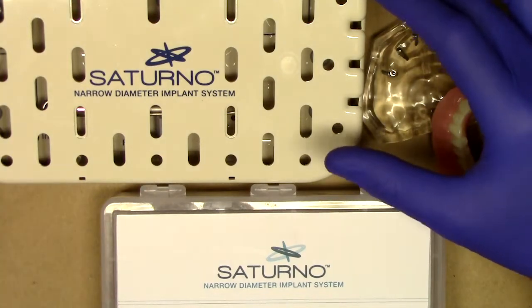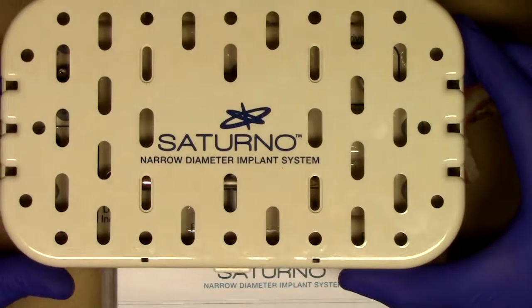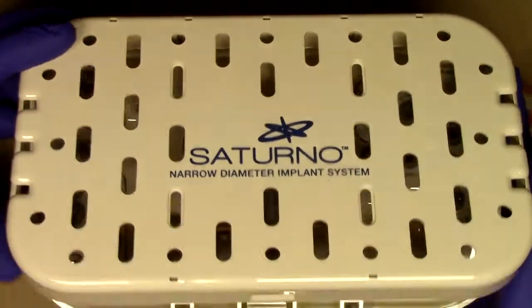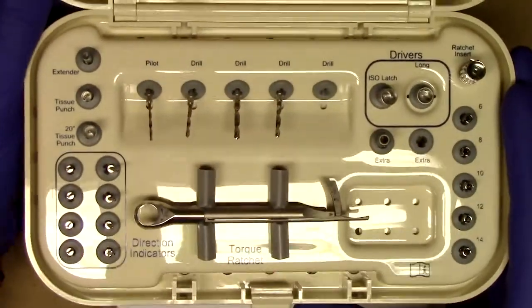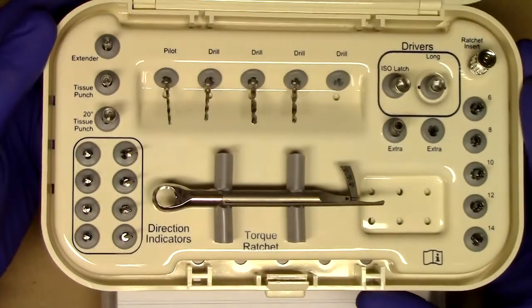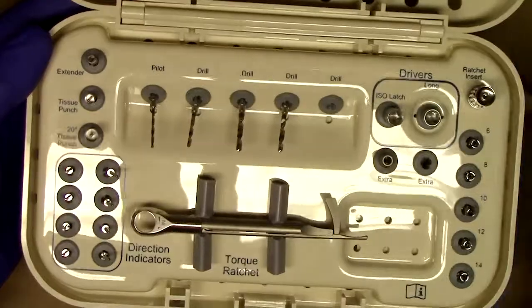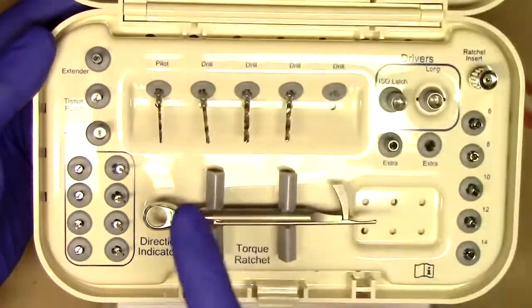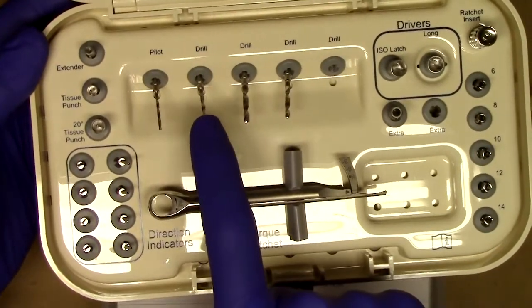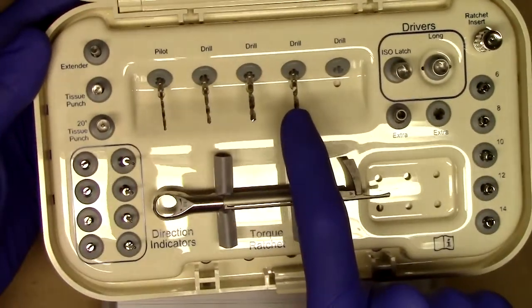Also included in the Saturno narrow diameter implant system is a surgical kit, very similar to what you have also experienced with Lodi. This all-encompassing surgical kit includes everything that you would possibly need to place and utilize a Saturno narrow diameter implant. Going through the drilling system, you can see here just like Lodi we have a pilot drill which is 1.2 millimeter, a 1.6 millimeter drill, a 2.1 millimeter drill, and a 2.4 millimeter drill.